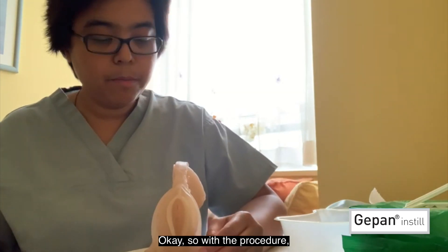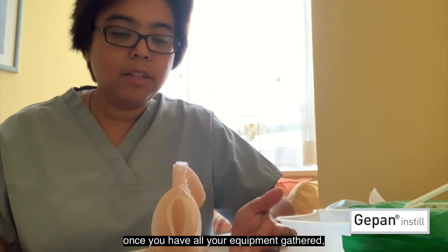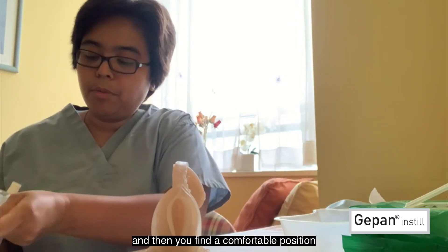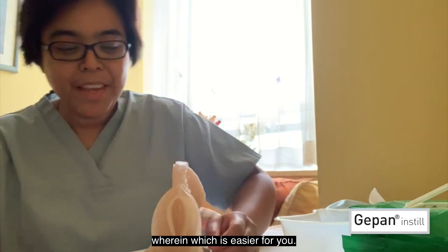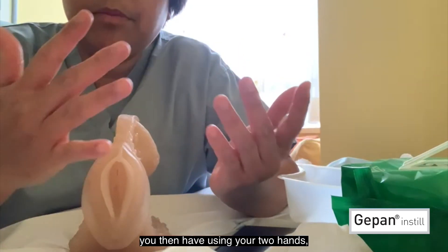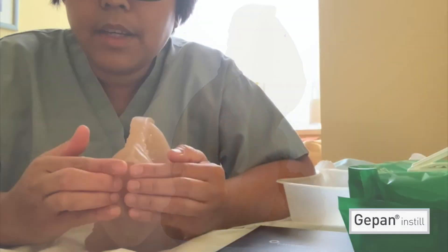With the procedure, once you have all your equipment gathered and you've prepared your intermittent catheter, find a comfortable position that is easier for you, and then you have to locate where your urethra is. Once you position yourself, using your two hands, separate your labia with your fingers like this.